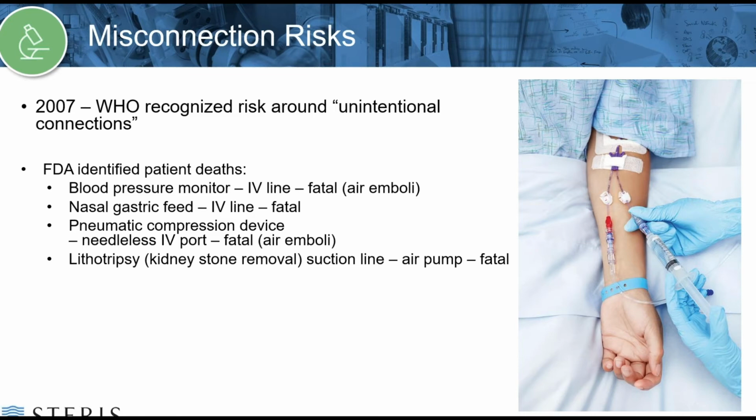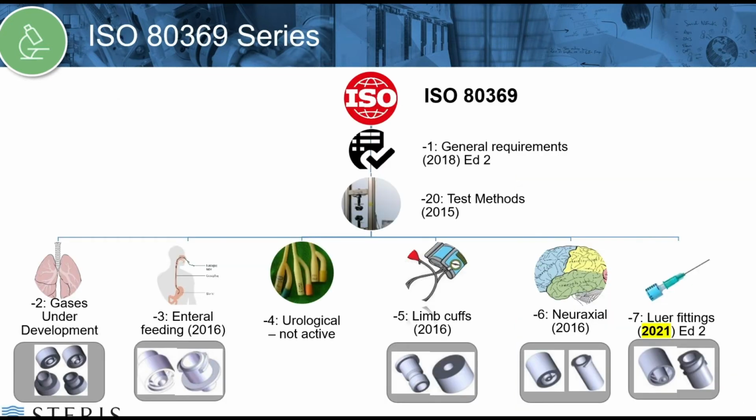To address this risk, a working group was formed, and this group developed a series of connectors for various applications in a healthcare setting, including the Luer connector. The intention for the design of these connectors was that the various geometries used engineered out, for the most part, the risk of misconnection. These connector styles or designs feature in the 80369 series of ISO standards.